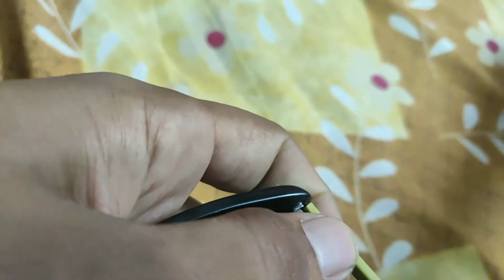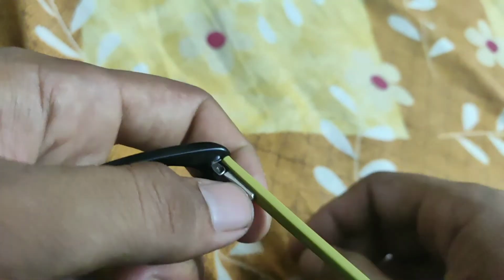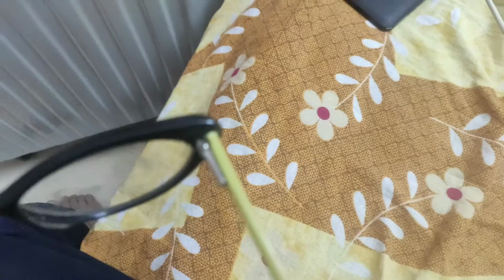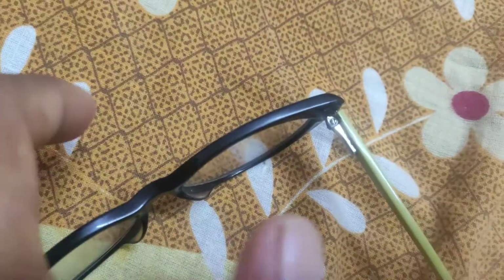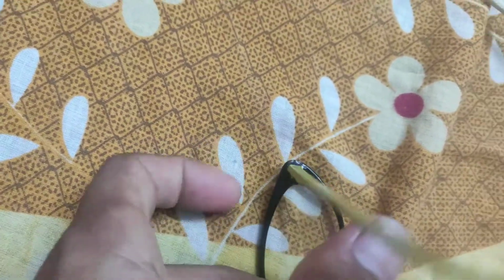You have to fix that screw inside that hole using a screwdriver. Now our specs are serviceable. Now we can hold it like this.